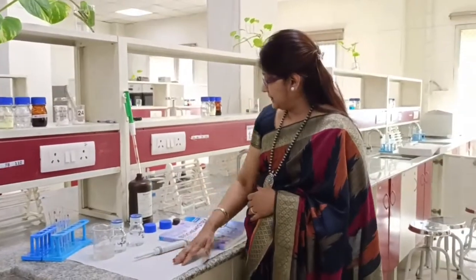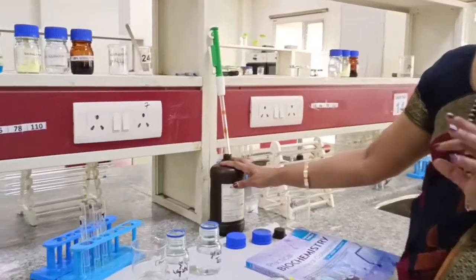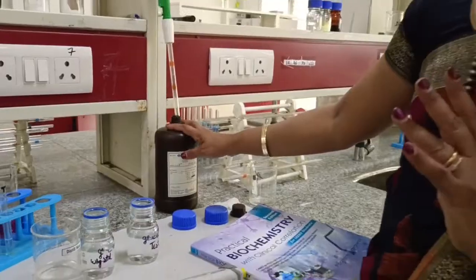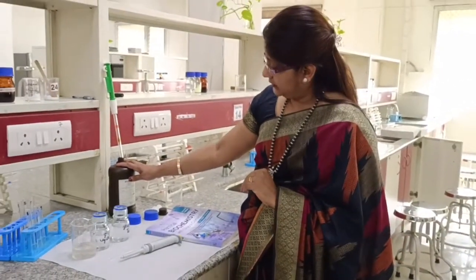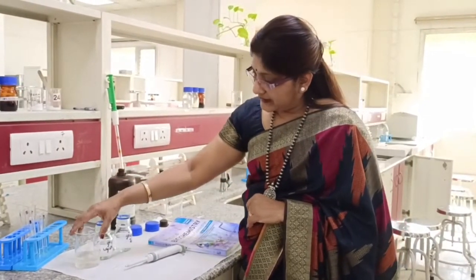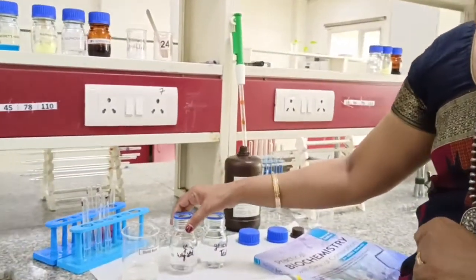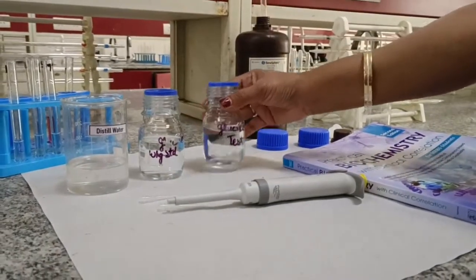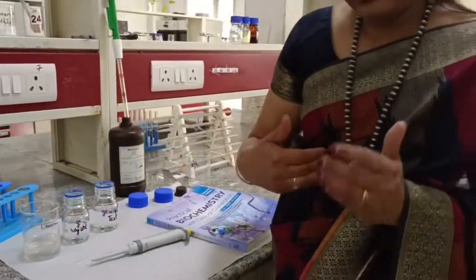For this test we need one glucose oxidase peroxidase reagent. This reagent contains two enzymes — glucose oxidase and peroxidase — one substrate of the dye that is 4-amino-antipyrin. These are mixed in the phenol substrate and this is stable at room temperature. We also require distilled water, a glucose standard solution which is 100 milligram per deciliter, and the test solution in which the glucose is to be estimated.